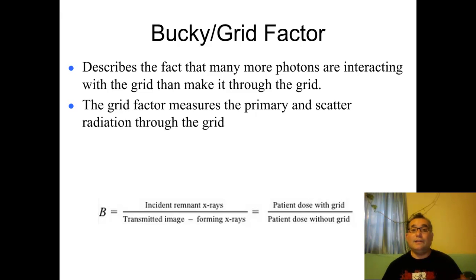And we're not talking about a little bit of dose. We are talking about 4, 5, 6 times the dose, depending on the grid ratio utilized. Multiply that by multiple views, and you'll see how things start to add up.